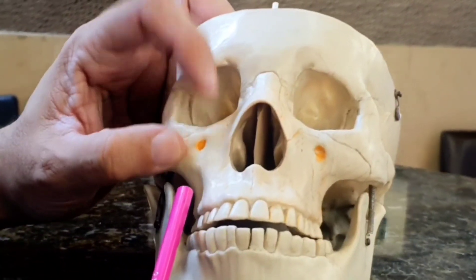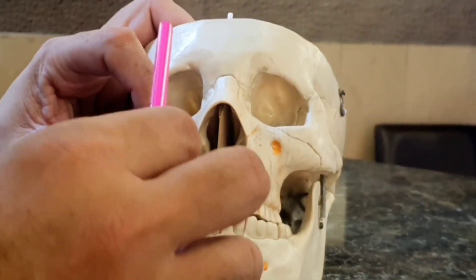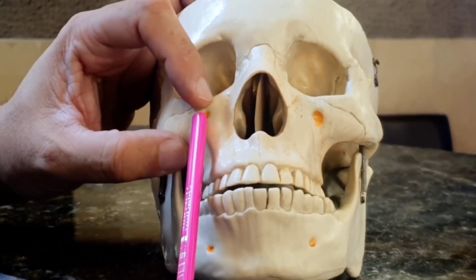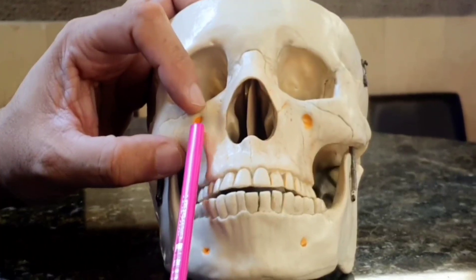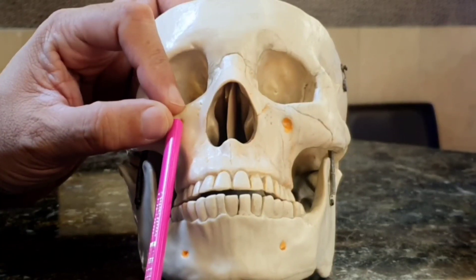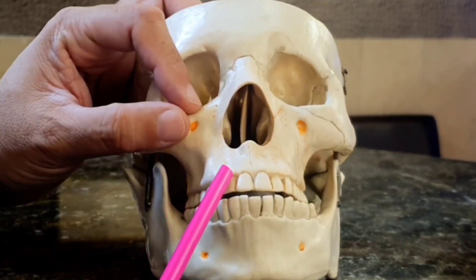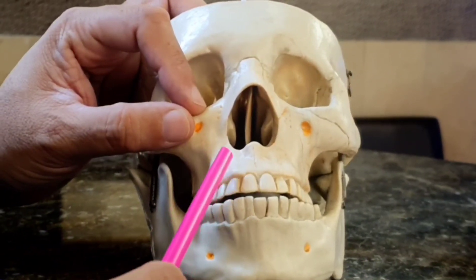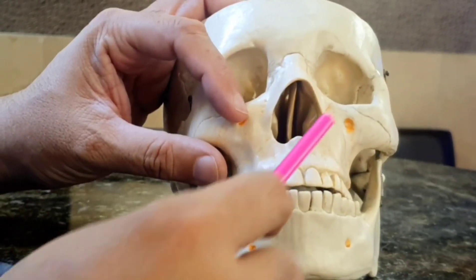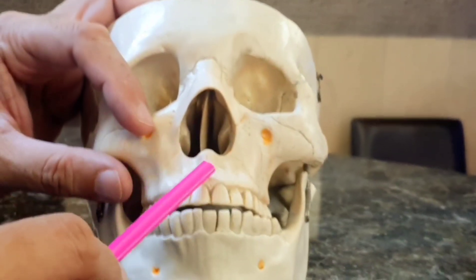You put your finger on top of the socket without putting your finger inside the eyeball area, and then you aim with proprioception into that region. When you get your needle to the height where the infraorbital foramen is, you keep injecting the anesthetic a little bit and you'll feel a little bump — that's where you inject it. Once you inject there, your canine area and premolar will be numb, including the lateral incisor and partly the central incisor. The central incisor might not be fully numb because there could be collateral crossover from the other side.